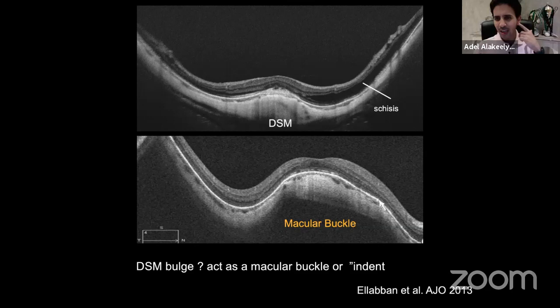This last part was not very clear. Can you repeat what you said about the closure? Normally, in macular holes, the inner layers close first, and then the outer layer. When the inner layer closes and the outer layer hasn't closed yet, you get this hyporeflective area, which is what we call foveal lucency. We thought to study that in relation to different types of gases: if we use SF6 or C2F6 or C3F8, is there a difference? We didn't find a big difference; it's just the way that the macular hole closes.